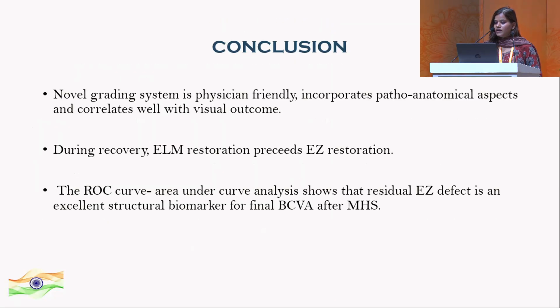We thus concluded that the novel grading system is physician-friendly, incorporates pathoanatomical aspects, and correlates well with visual outcome. During recovery, ELM restoration precedes that of EZ, and the ROC area under curve analysis shows that the residual EZ defect is an excellent structural biomarker for the final best corrected visual acuity after macular hole surgery.